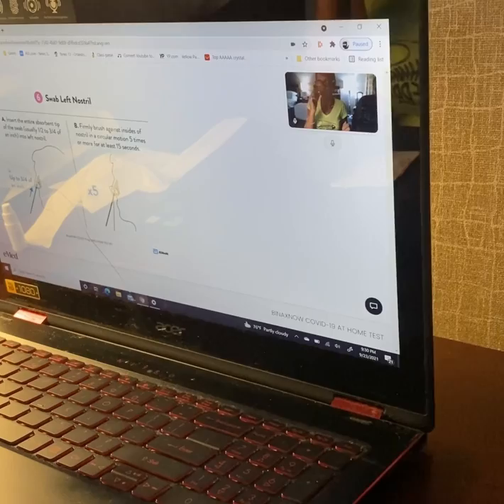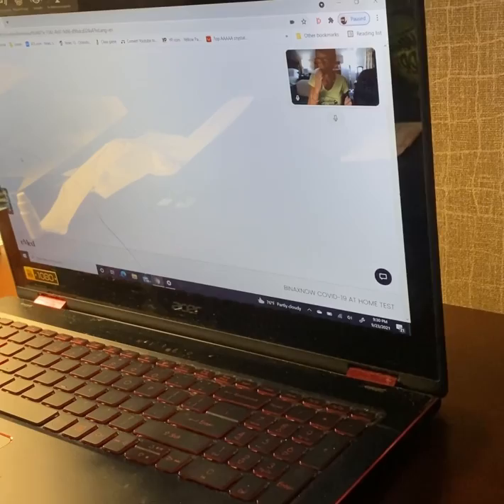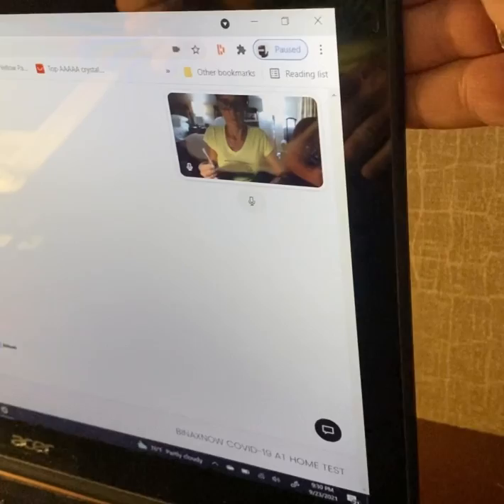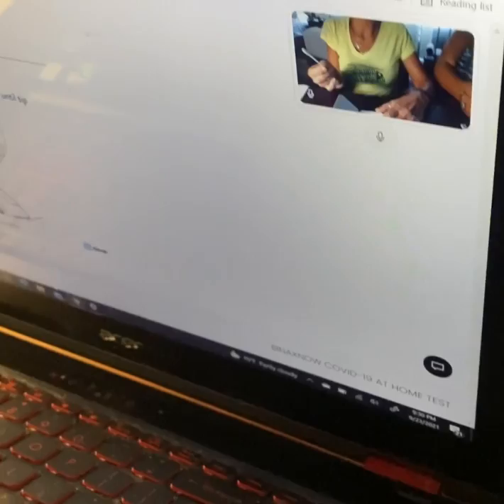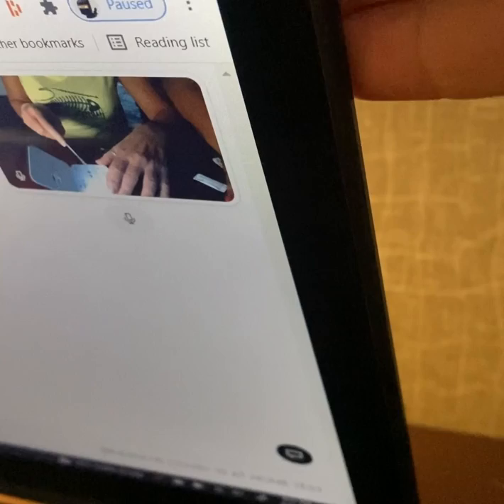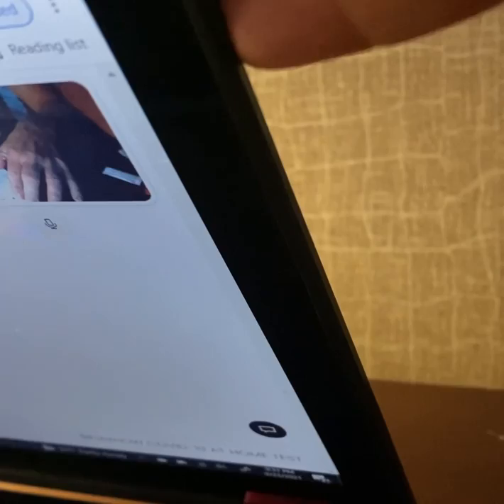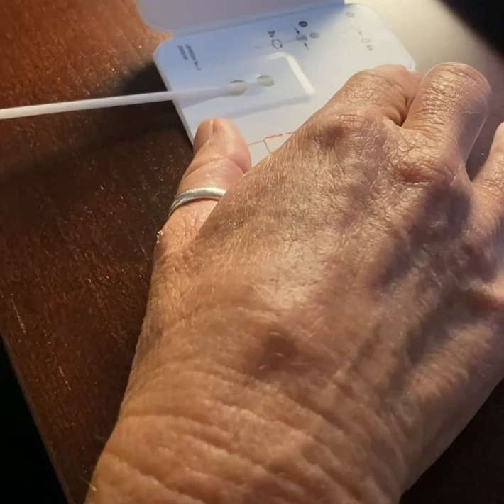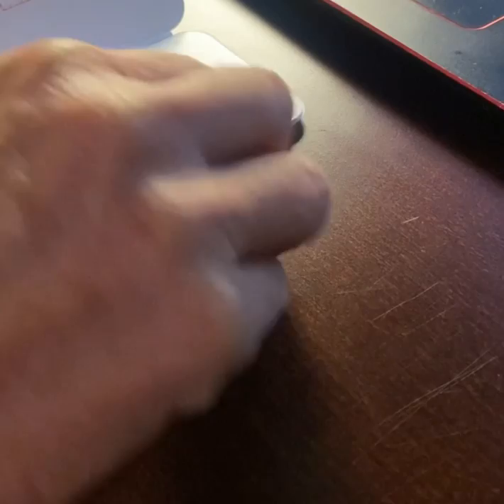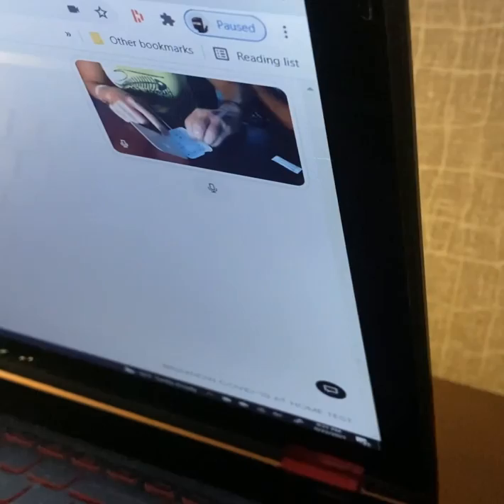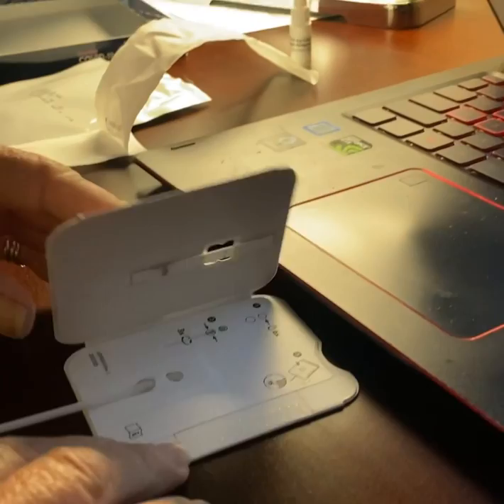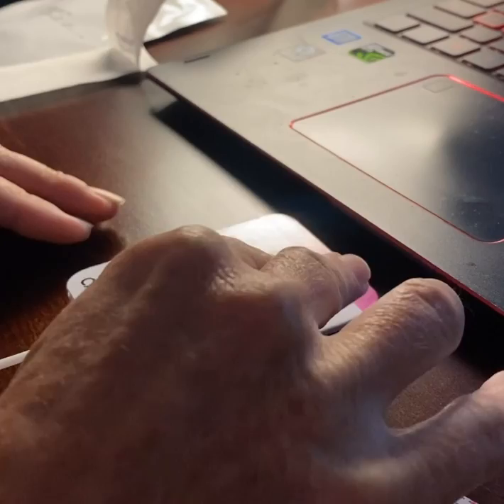Okay, I'm done with that. We lost connection. Wait, what happened? Okay, I'm done with that. Put it in like you did on the bottom. Insert it and then roll the swab shaft three times to the right. And then just leave it in the card. Alright, now peel off the adhesive liner from the right edge of the test card and then close the left side of the card and keep the card face up. Press this down.